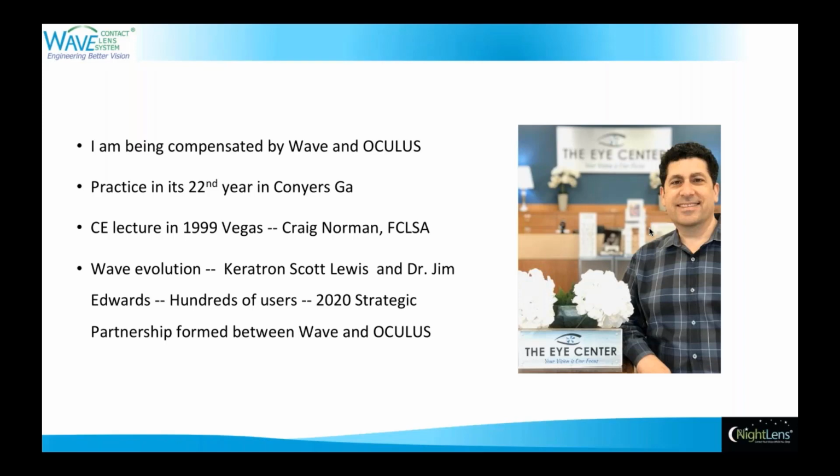So I did want to give a little background about where WAVE has come from and where they're headed, and the story of how they got started. So Scott Lewis was the representative for Keratron, selling the Scout topographer, the handheld topographer. And he was at Vision Expo demoing his product. And across from him was an optometrist out of Oklahoma who has a passion for computer programming. And Dr. Jim Edwards had designed a software program to demo eyeglass frames in the office and show them up on the screen.